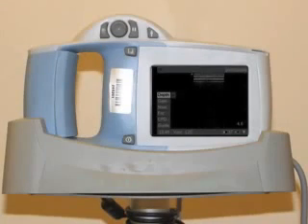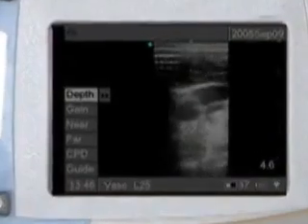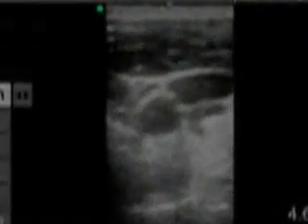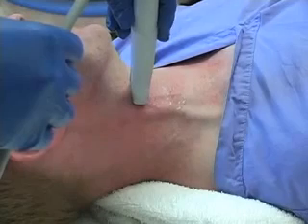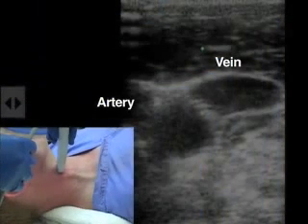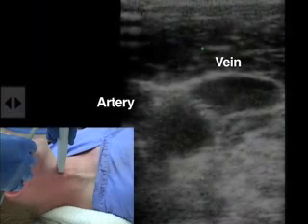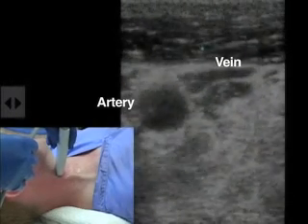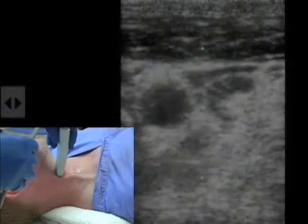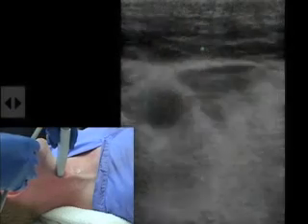Ultrasonographic guidance is becoming the standard of care in the placement of a central line. It can help to illustrate aberrations in the anatomy, facilitate rapid placement, and decrease the risk of inadvertent arterial puncture. To identify landmarks with ultrasonography, the probe is placed directly on the needle insertion site. The vein and artery are identified on the image as circular and black. The vein is identified by applying gentle pressure with the probe — the non-muscular vein will collapse easily, whereas the artery will remain relatively circular.